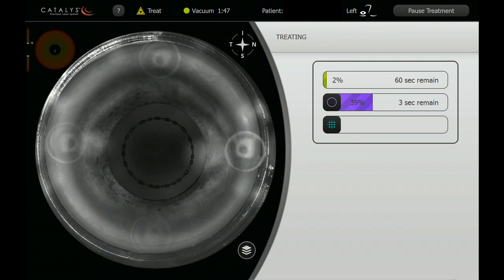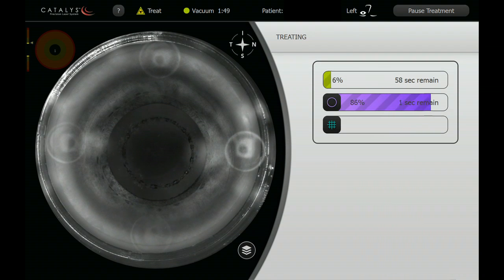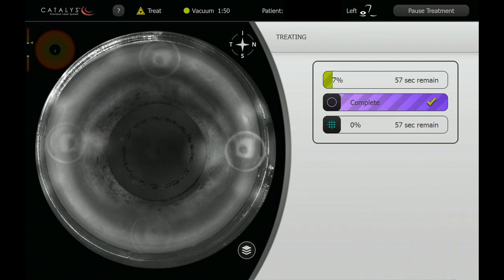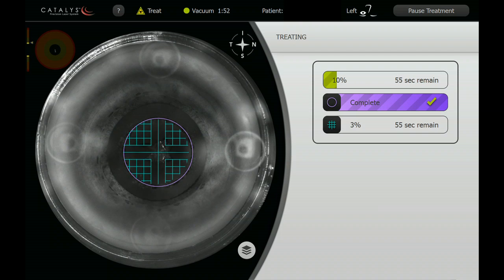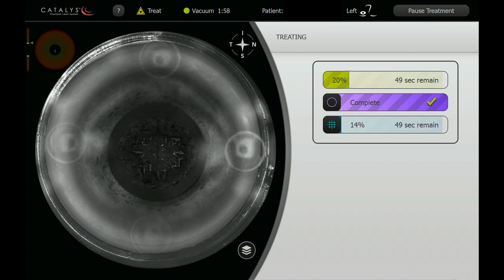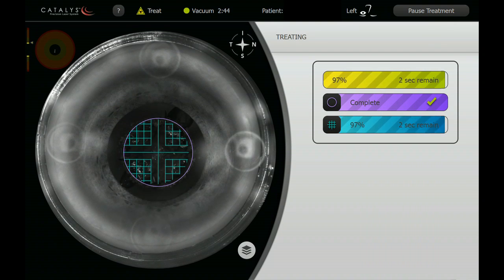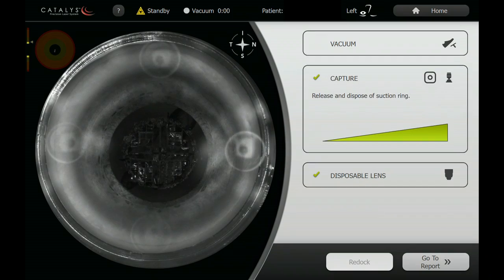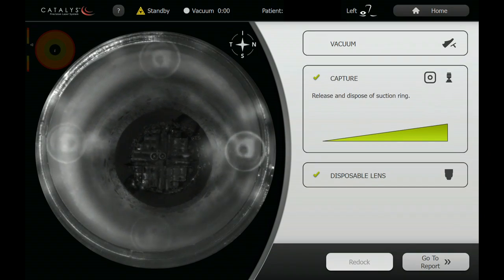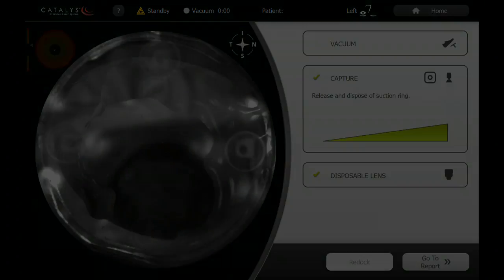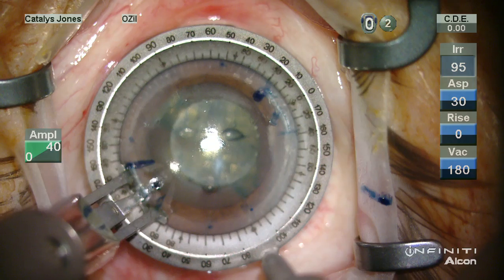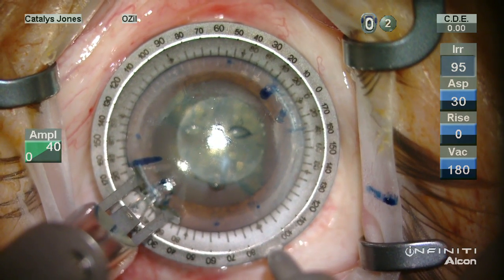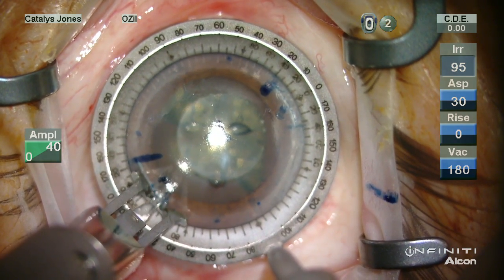Now we're going to ablate the capsulotomy in approximately four seconds, and here the laser is cutting into the lens, which does take a little bit of time. This patient has a fairly thick lens. We've edited this for conciseness — overall vacuum time was well under three minutes, which is rather typical.